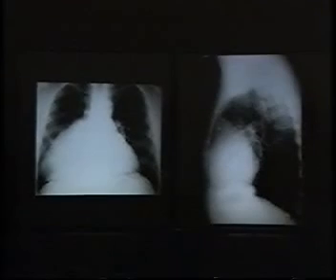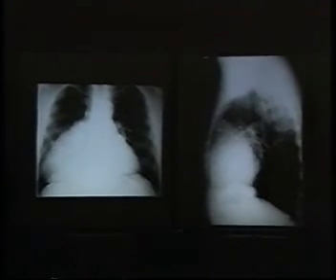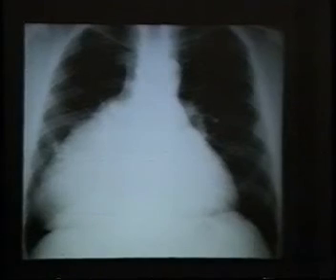of the heart because there's not much in the way of nodal tissue there, unless you have a patient such as this where the Hodgkin's disease is infiltrating the thymus. And then the thymus can hang down just like a thymoma, and I think you can almost make out perhaps a sail sign at the base here. And this is a right pericardiac mass circa 1991. This did not exist 4 or 5 years ago.